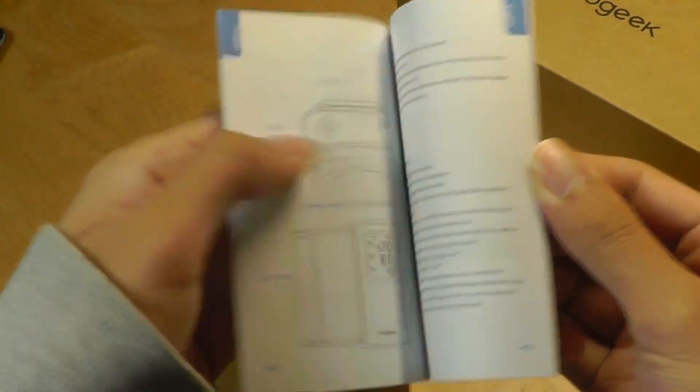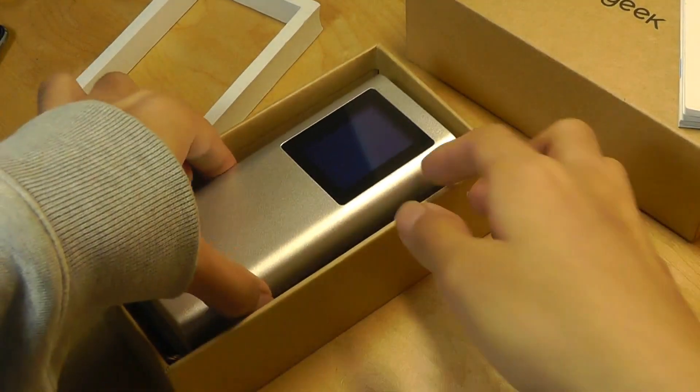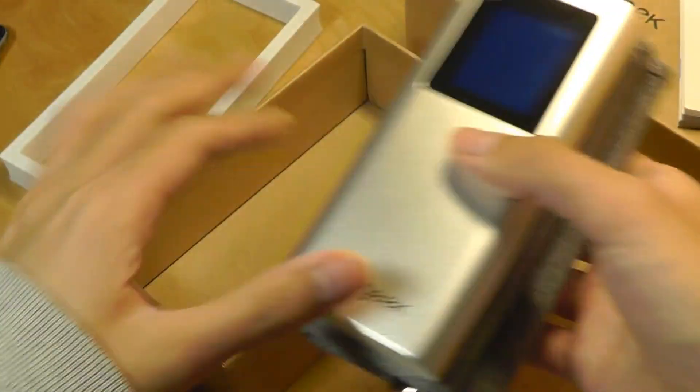On the inside we have just the instruction manual, the quick start guide, and we've also got the unit itself which is sitting underneath, and that's it.